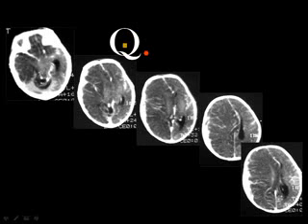Tumor. Blocking the foramen of Monro on the right side. Where is the tumor? The falx is displaced. Yes, the falx is displaced, but there is no tumor here. You can see enhancement of the basal cisterns and the cortical sulci, which is a case of meningitis. And the cause of the swelling of this hemisphere is the ischemic changes, which usually accompany meningitis due to stenosis and vascular thrombosis. So how was it due? And also edema, ischemia and edema.